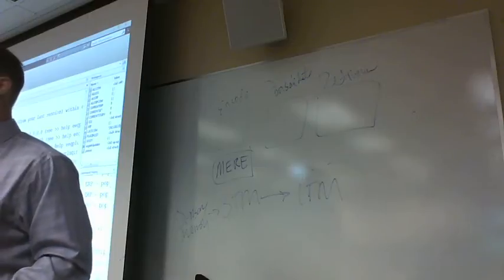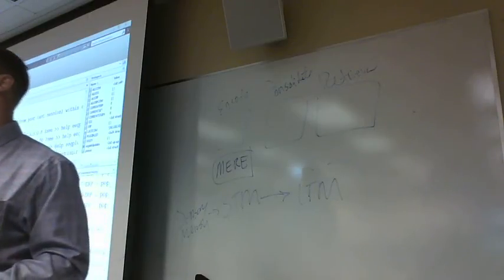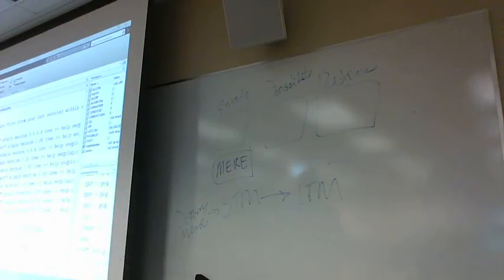The hypothesis, of course, in that case would be a comparison to see: is there more information available about potential differences within the spectral domain than there is in the averaged ERP domain? Look at the exact same thing with a different lens. Is there something different? Do they differ, I should say? That's a hypothesis that you can test. Or you could ask something else.